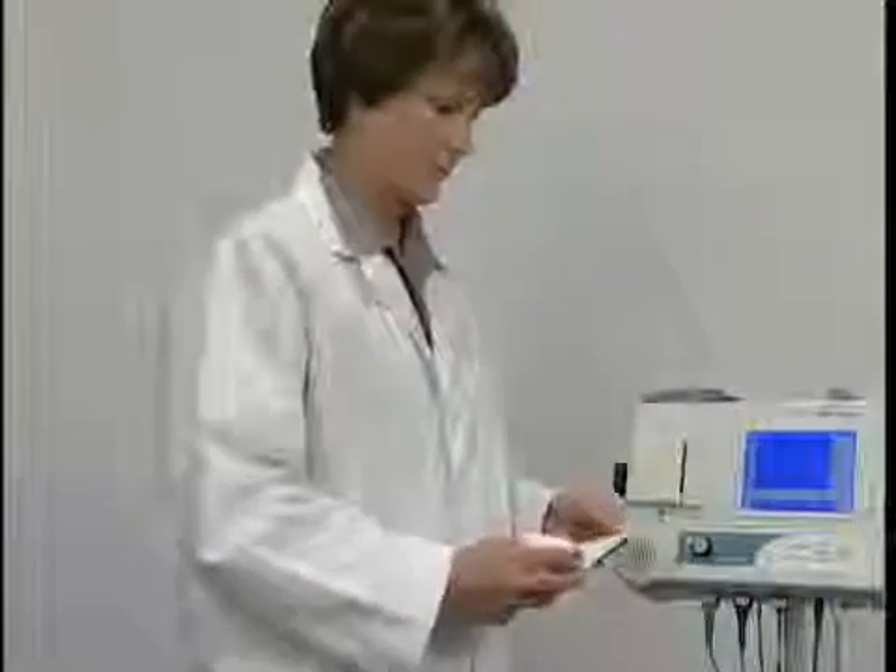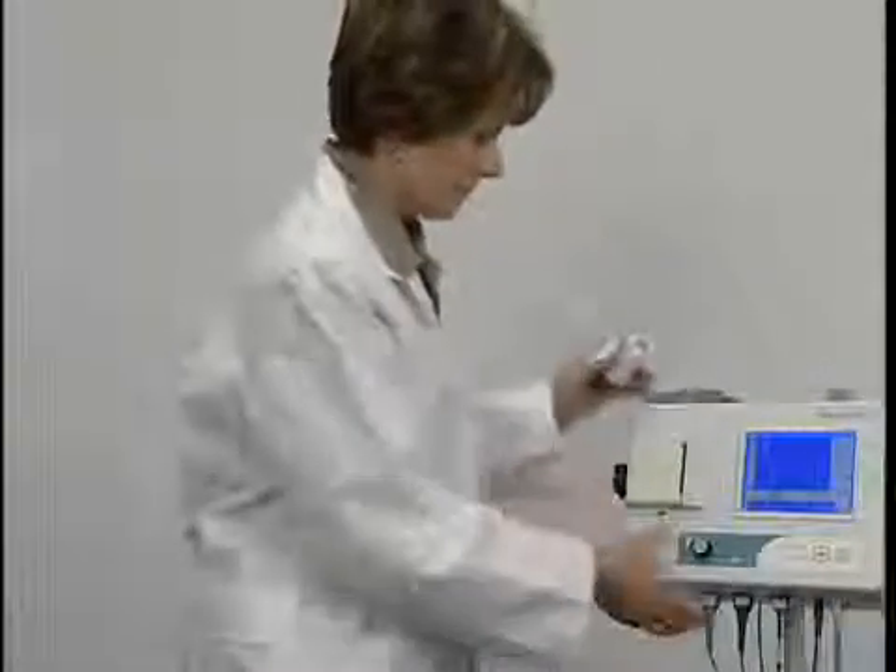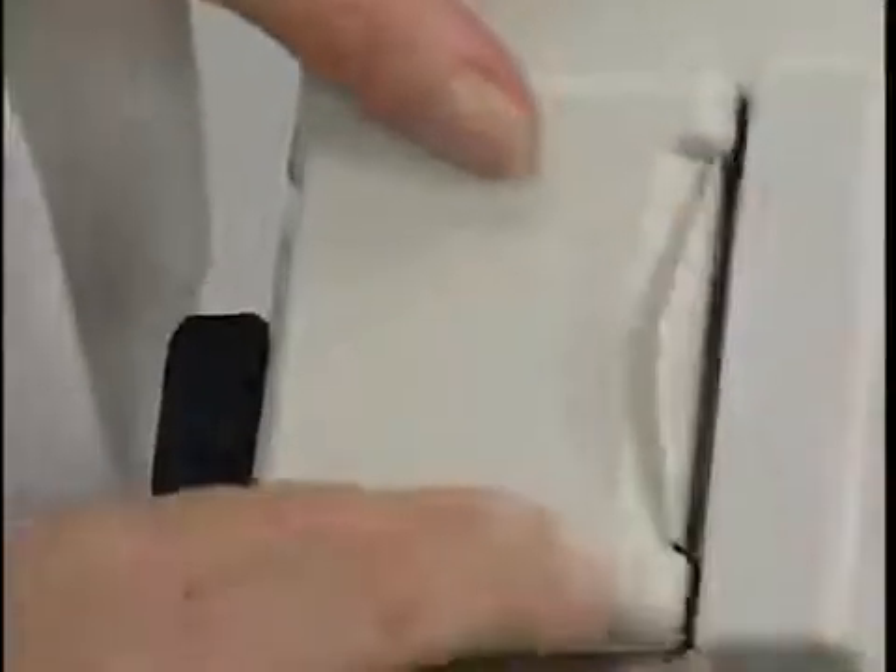For replacing the label paper in the built-in printer, press the blue button under the dispenser to open the chamber and place the roll in the dispenser as shown. Press the feed button to feed the paper to ensure proper placement.